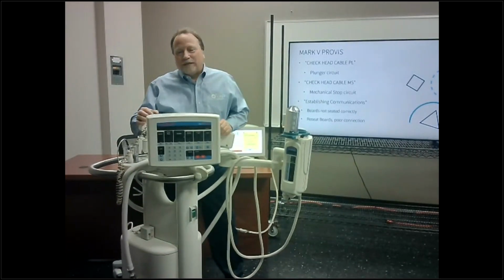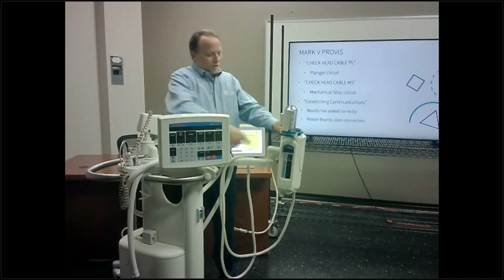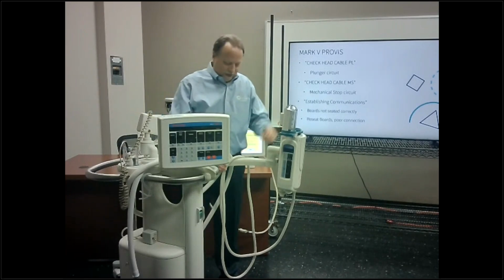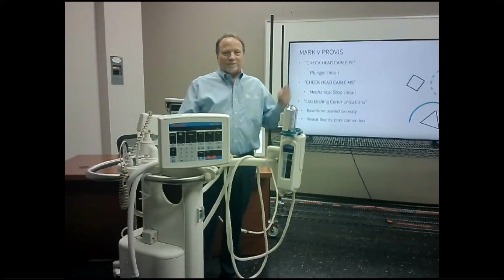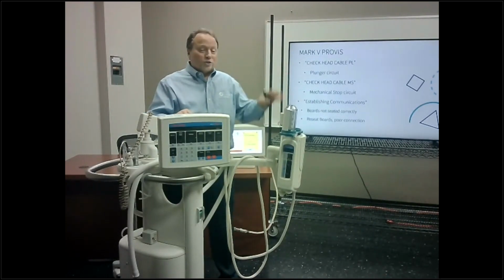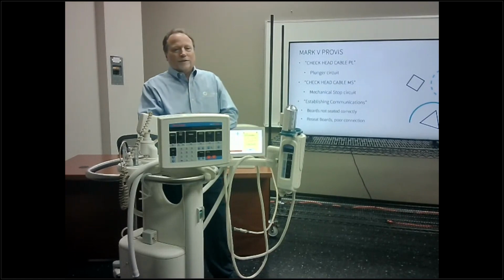Check head cable, PL. It's not the head cable. It's in the plunger circuit. The ram goes up and down. It's not the head cable usually. This is a very sturdy head cable, and it's not like the Stealth that breaks all the time. So it's in the plunger circuit. That's where your issue is, not the head cable.